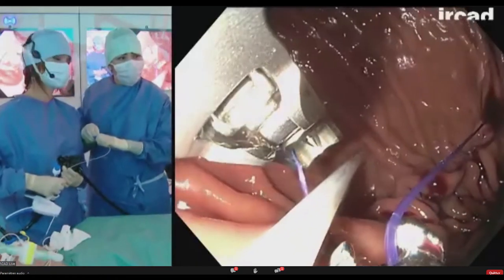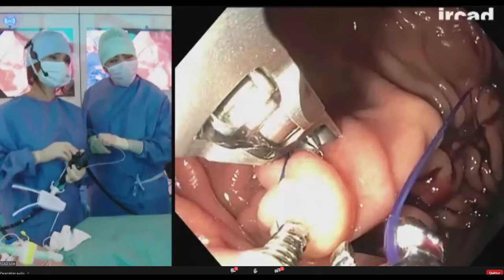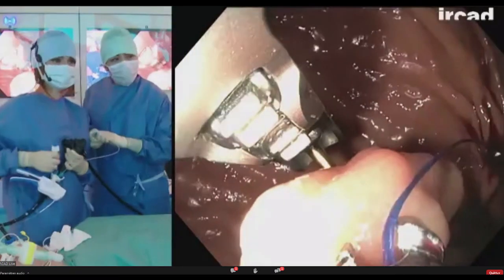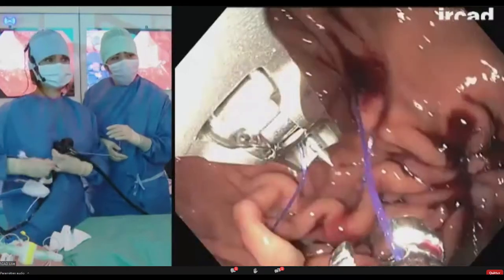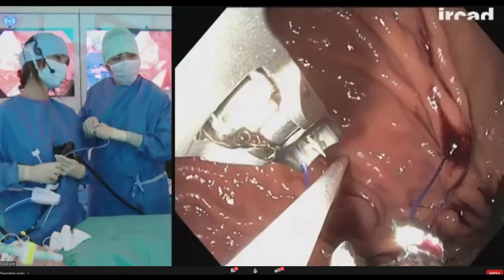Yeah, actually we just sent to publication our Brazilian consensus with around 2,000 cases, Lee and Silvana. And the significant bleeding, meaning that you have to do something to take care of the bleeding, was 0.1%. So it's pretty much interesting and significant.